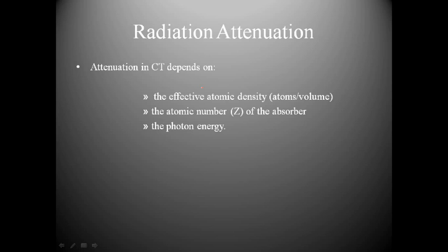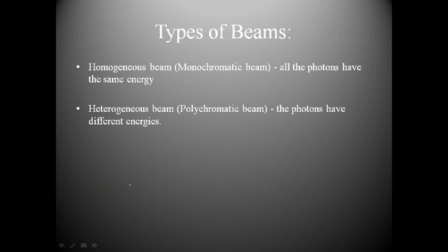Also, the photon energy, how much energy is behind these photons, will affect how much attenuation is demonstrated. We saw in our previous lecture that this is remedied by a filter, which removes the long wavelength radiation that would just contribute to patient dosage and nothing more. There are two types of beams, and we want only one of them.